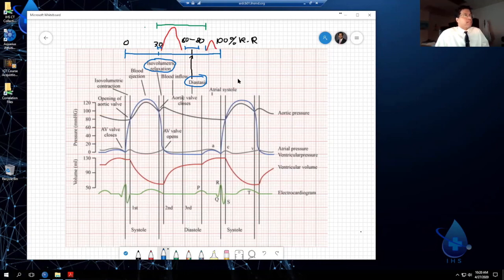So if you can get 30%, 35%, perfect. Now on those old 64 slice scanners, in some places you're still using 64 slice scanners, just to make the tech's life easy, we just said, all right, just reconstruct 30 through 90. That way I know my two sweet spots will be incorporated into that data set.